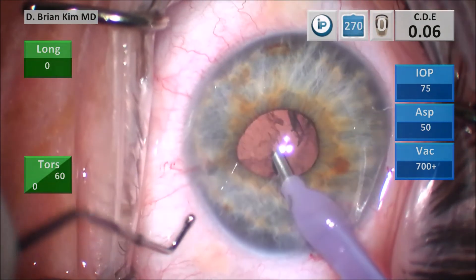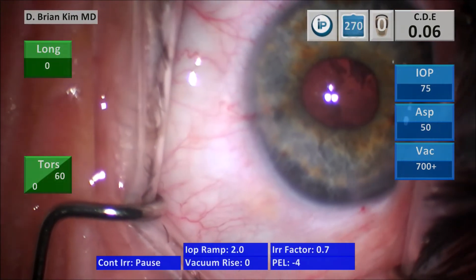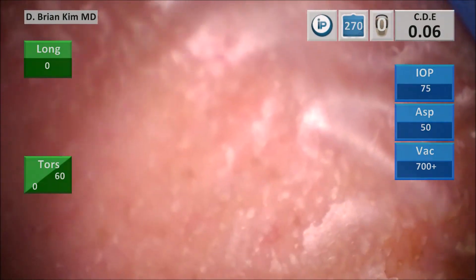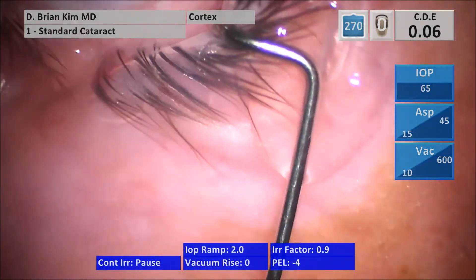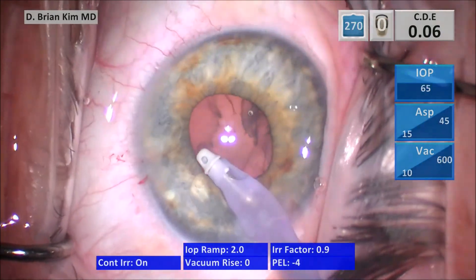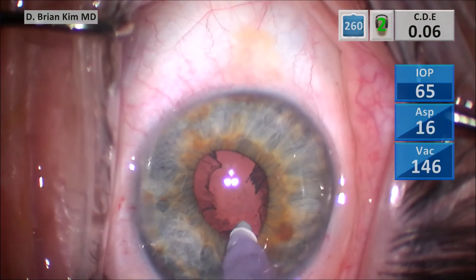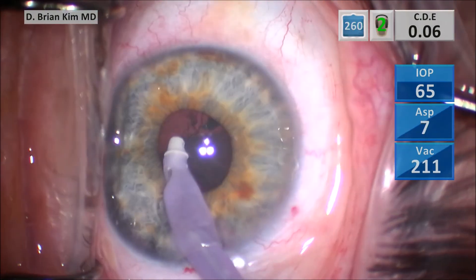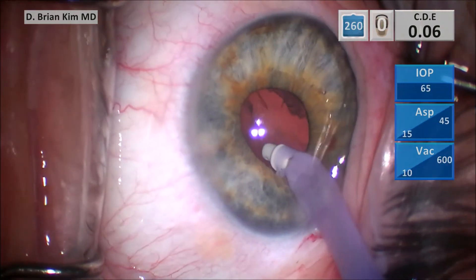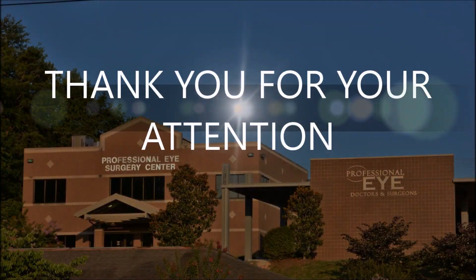I want to emphasize that for ultra-brunescent lenses and weak zonules, I do not employ this technique — I think you should use iris hooks, because the lens density requires a lot more ultrasound and vacuum. But otherwise, for small pupils with soft lenses up to two plus NSCs, this technique works very well and is very consistent. I haven't had any complications or difficulty. Because this is really a pupil-independent technique, I'm able to do very safe and efficient surgery. I hope this was helpful and offers a different way to look at small pupils without being intimidated by them. My use of the complex code has dramatically been reduced because of this.